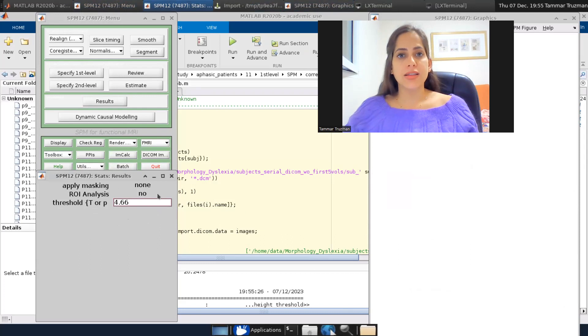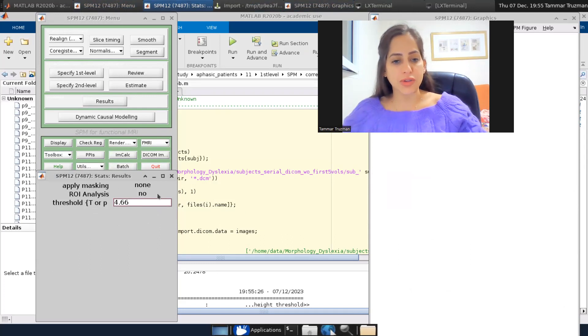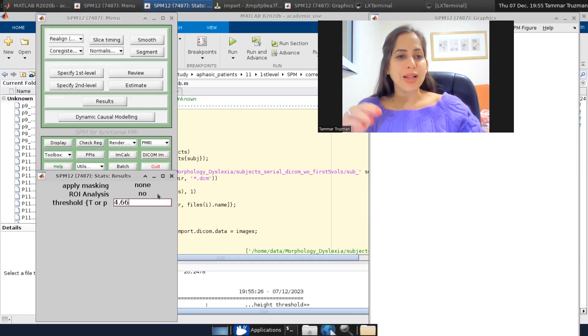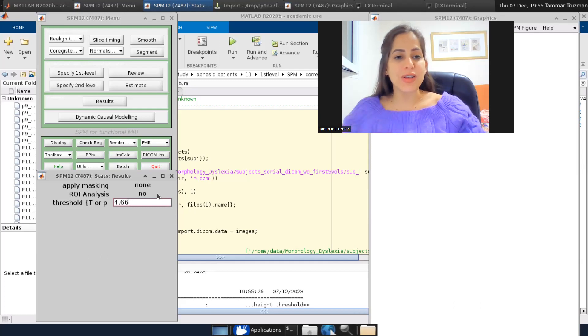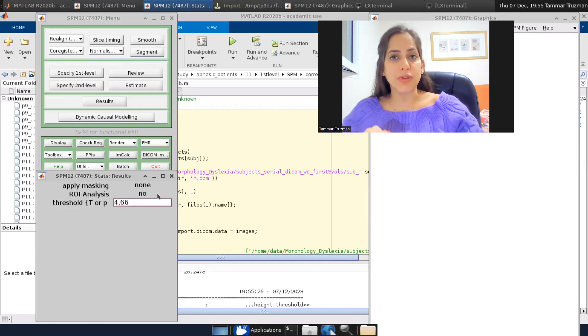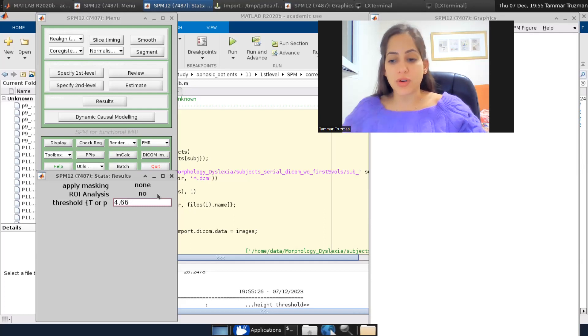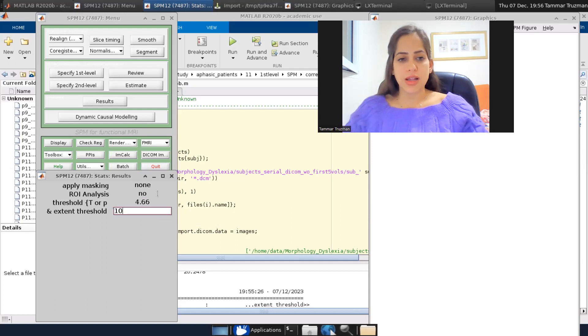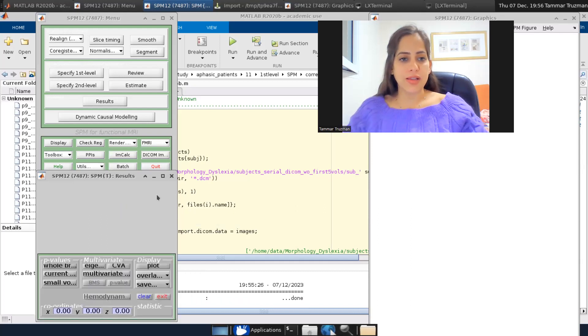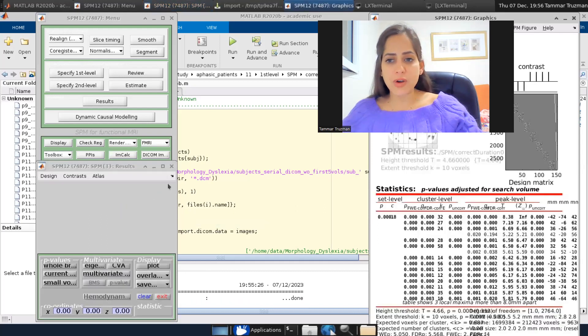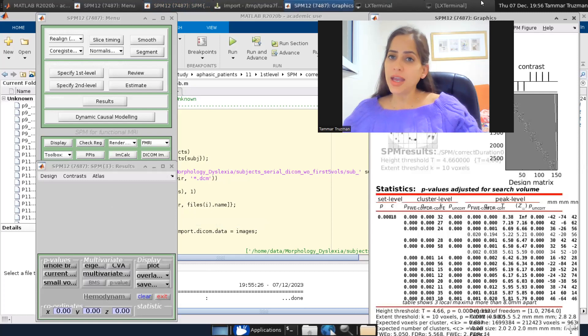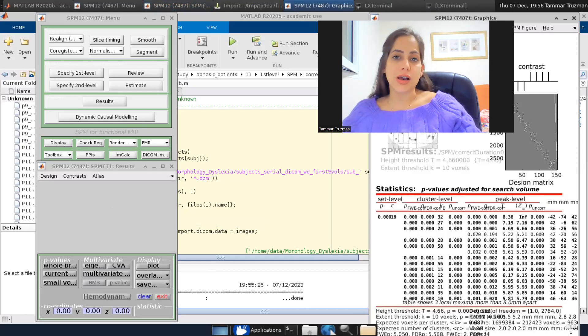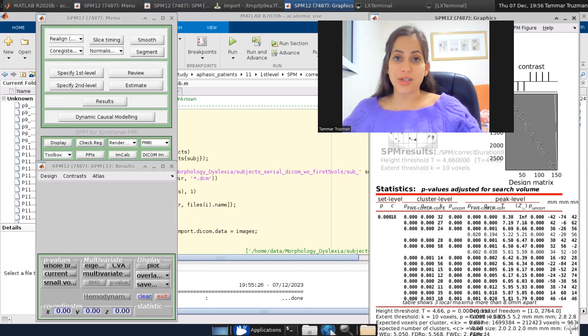This is the T high threshold that corresponds to multiple comparison correction according to family-wise error p equals 0.05 only within my VOI. So I'll go again with an extent threshold of 10 voxels. And now you can see there are much, much less results because I applied correction, which I did not before.